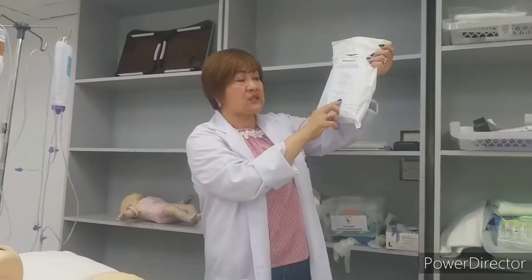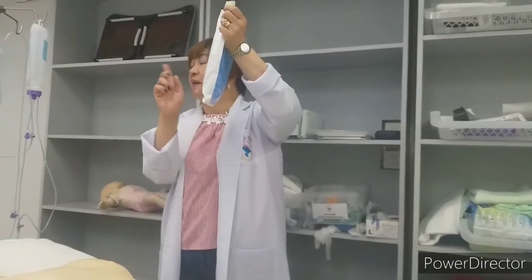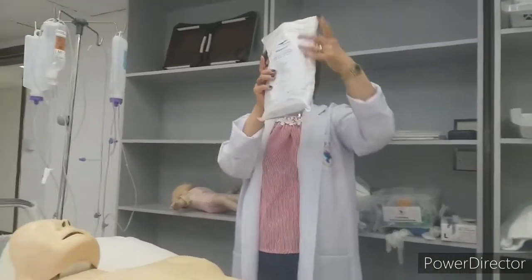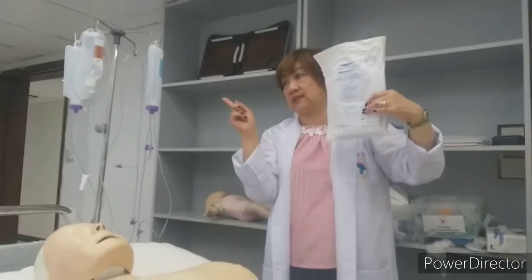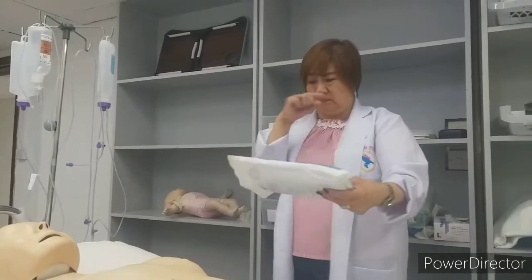So there is a "no reuse" symbol. There are pictograms, we call them pictograms. This pictogram says no reuse, meaning do not use it for the second time. Only one-time use. Okay?